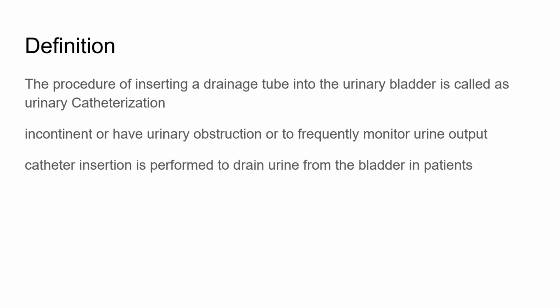At the same time, long-term catheterization is not advisable as it is associated with the risk of urinary tract infection. So urinary catheter insertion is done for all the above said things. That is, to relieve the obstruction, to aid the incontinence, and to measure the output.